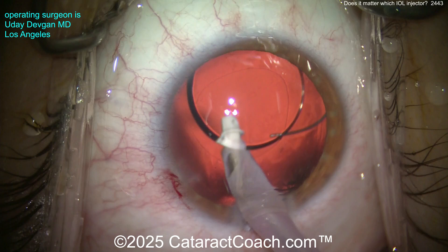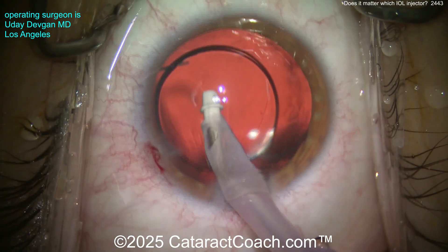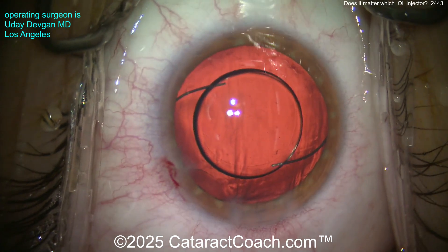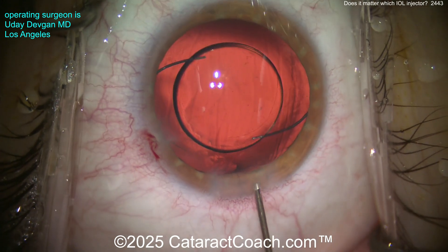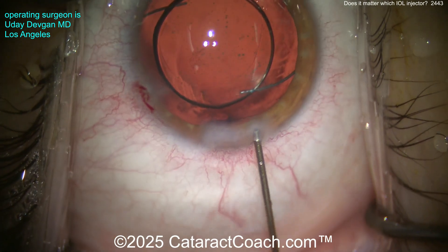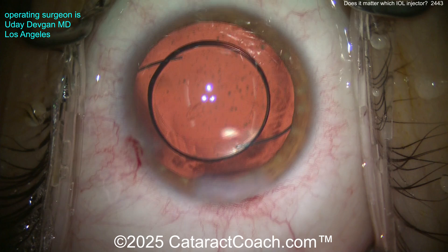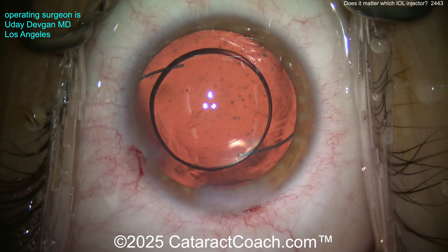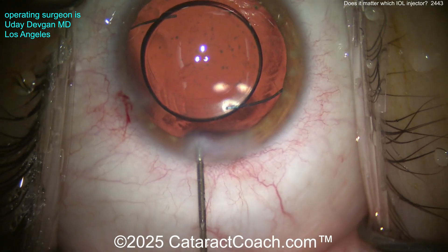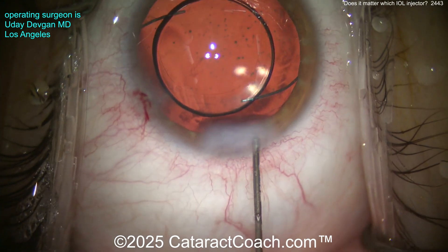There is a lot of very tight intellectual property around IOL injectors — that's why one company can't copy another company's design. So sometimes you have to use your own judgment as a surgeon and do what you think is best, including using one injector for a different IOL it wasn't specifically specified for. As you can see in the video, it works perfectly fine. This is your priority and your judgment as a surgeon — you do what is best in your hands, your situation, and for your patient.